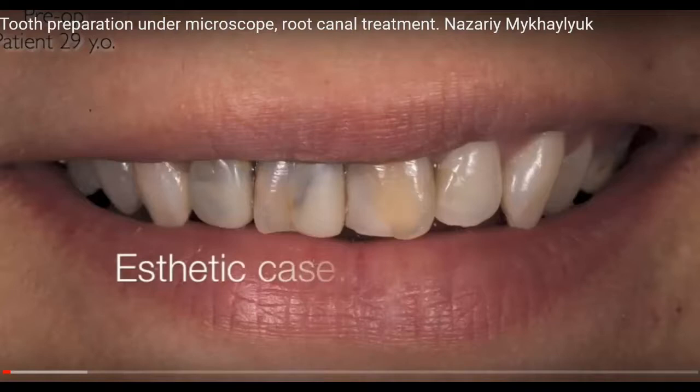Again, we want to make sure that as they're preparing the tooth that he or she is removing enough tooth structure to accommodate, depending on the type of material they're going to be constructing the crowns out of or fabricating the crowns out of. They need to ensure that they're removing enough tooth structure to accommodate that.